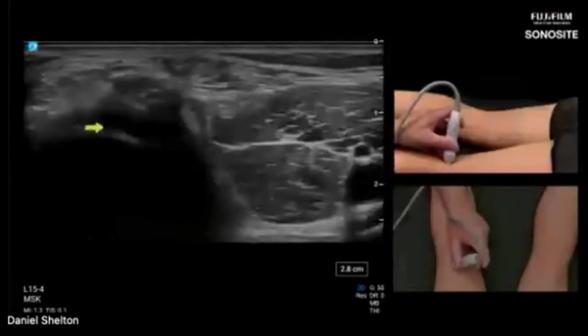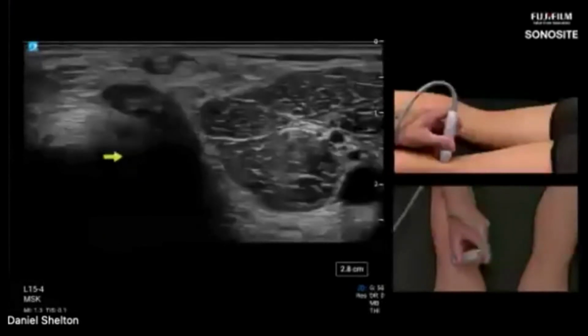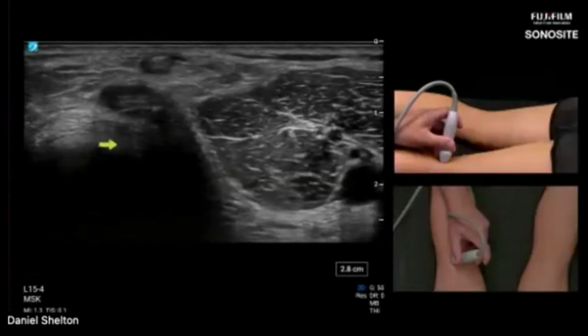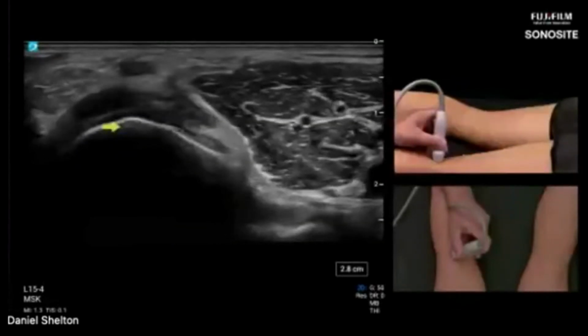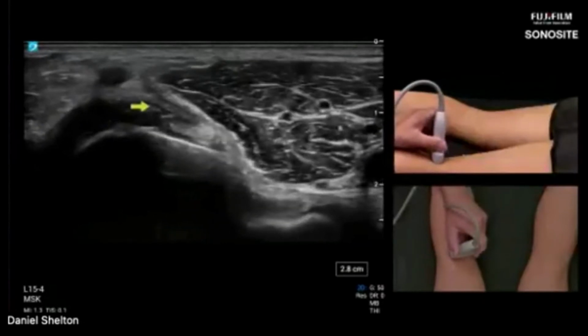So I'm going to go distally, distally, distally. I see the bone disappear. So now I feel like I'm probably in the joint line. So probably seeing some posterior meniscus, anisotropic artifact here, posterior medial meniscus here. And I'm going to go a little bit further distal until I see another bone. Okay, so here's another bone with no articular hyaline cartilage on top. And I see this big dark thing on top. Okay, so let's find out what that is.